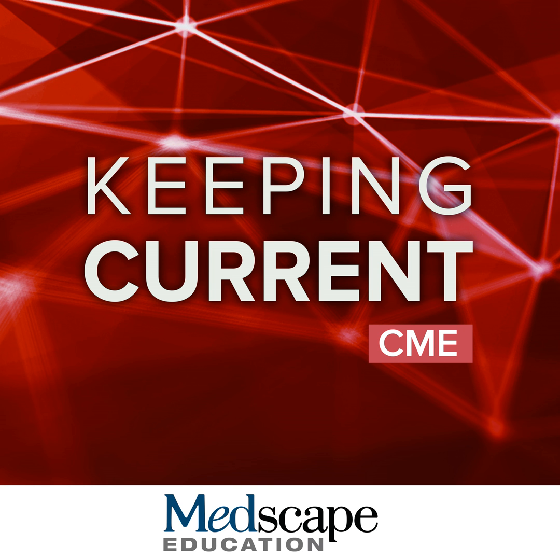Amyloid-related imaging abnormalities, or ARIA, are imaging findings of edema, ARIA-E, and hemorrhage, ARIA-H, that occur in the setting of immunotherapies targeting beta amyloid. ARIA is thought to result from the leakage of fluid and blood products when there is loss of vascular integrity, as a result of amyloid clearance from both the parenchyma and vessel wall with these therapies.